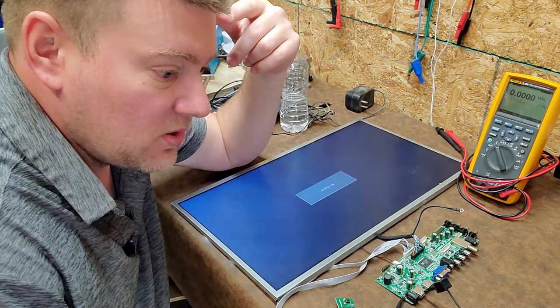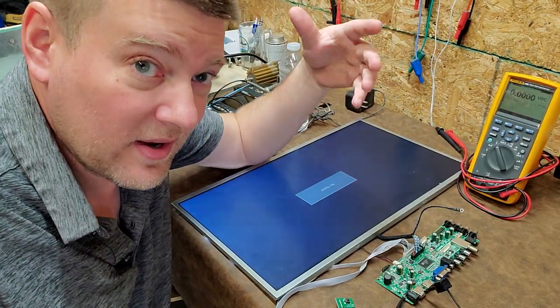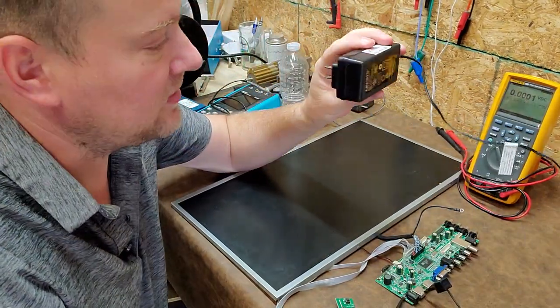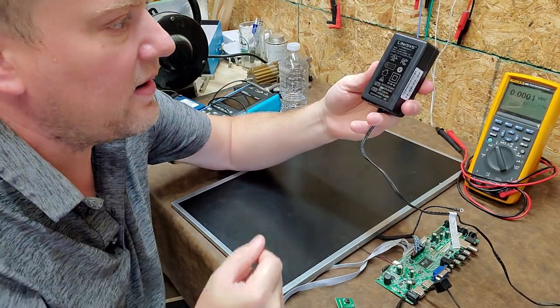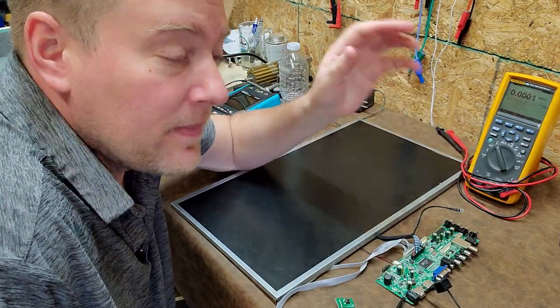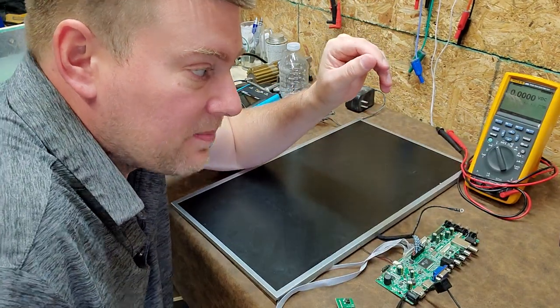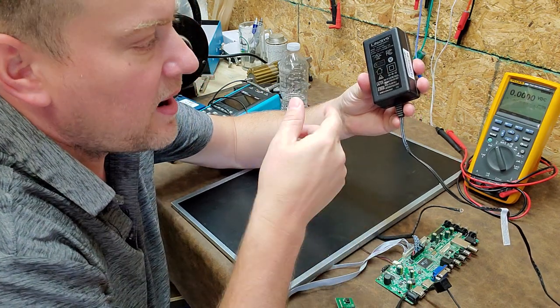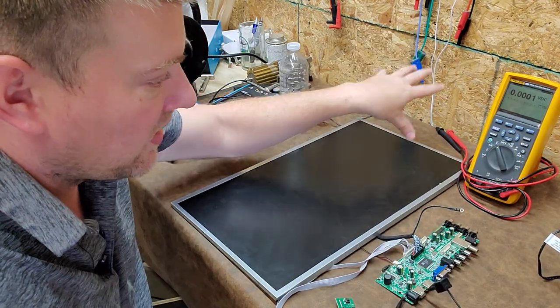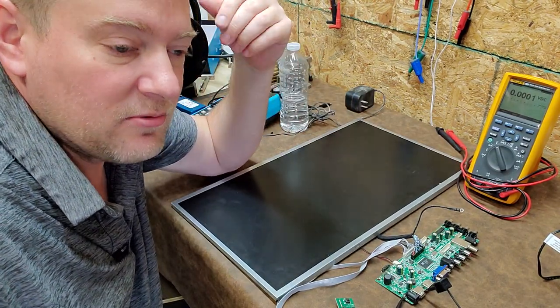So guys, that just goes to show you, if you don't have a regulated DC power supply, like a benchtop power supply, which is obviously the best way to test this kind of thing, I use my surplus bricks. And I always have surplus bricks, especially if they're higher amperage, like this is 3.5 amps. The only downside to this is I can't adjust the current. Adjusting the current is critical in case there is a dead short, the DC power supply will trip. This guy here, it does have probably some sort of short circuit detection, but it's still not as good as a regulated DC power supply where I can read out how much current is being pulled. And that usually helps me diagnose shorts.